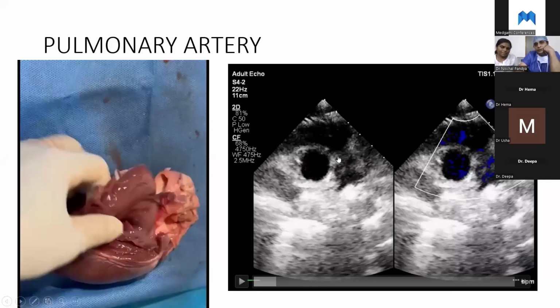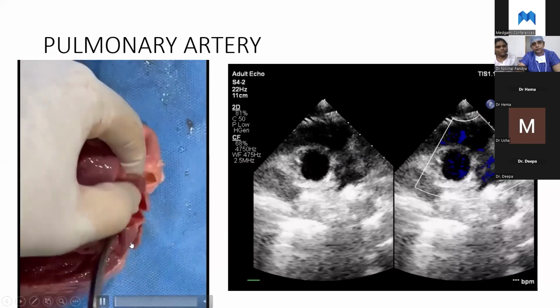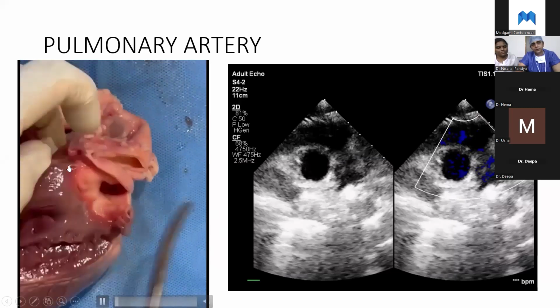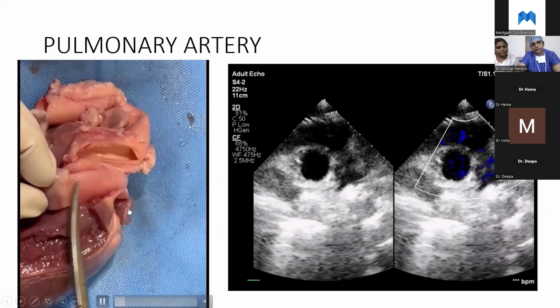Now here that we see, you're seeing the valve area. This valve area, as I depicted in the slide here. So, just trying to play this. So you see that valve, which is there and coming off at the cut portion basically.